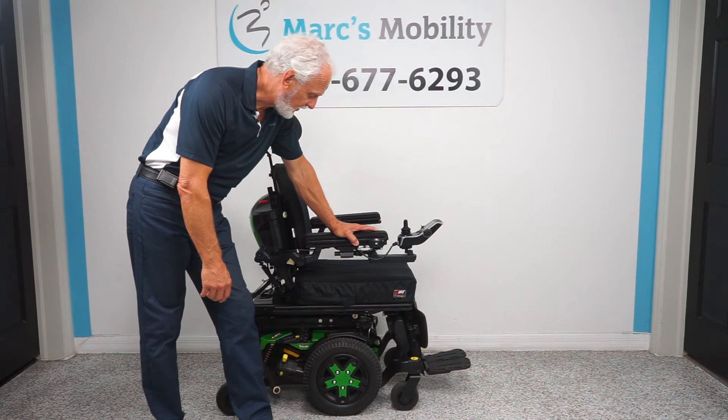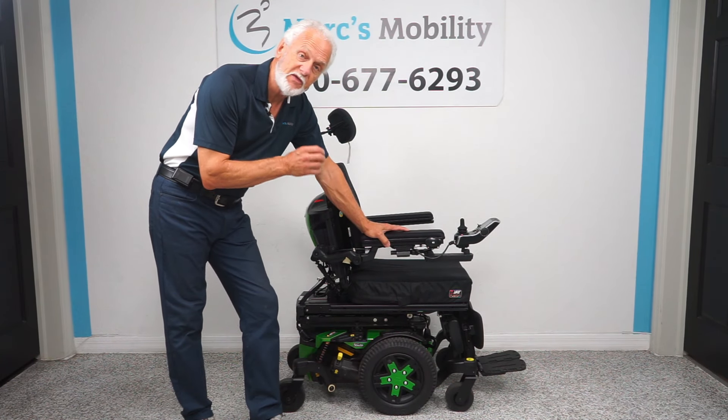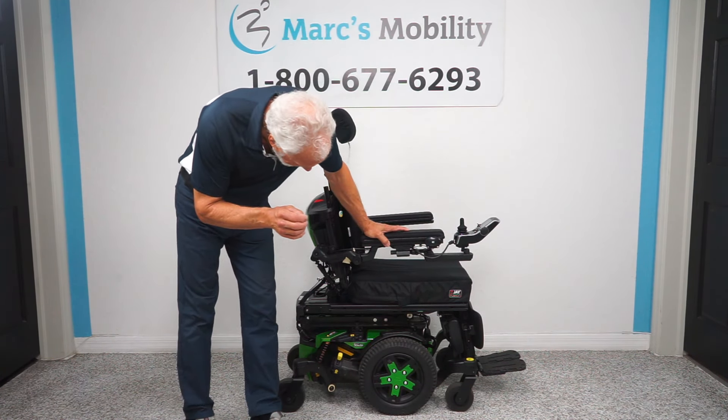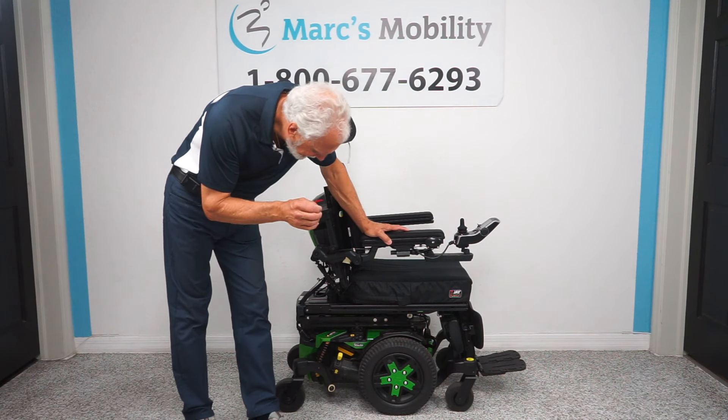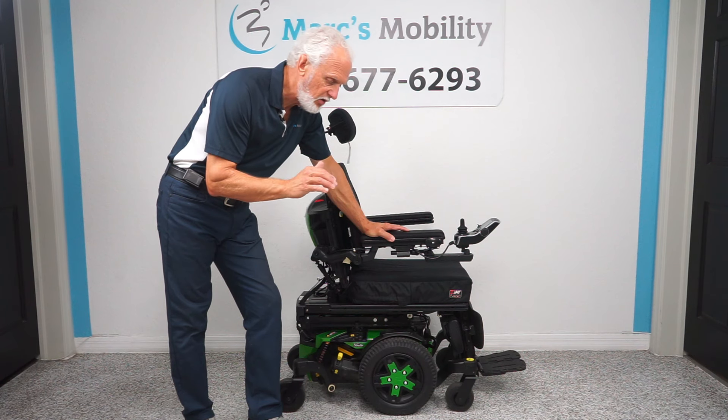Good morning, folks. This is Mark with Mark's Mobility. We have a gorgeous power chair here. It's a Quantum Edge 3 Stretto power chair with seven miles. It is fully loaded.